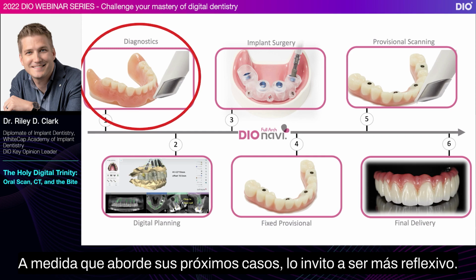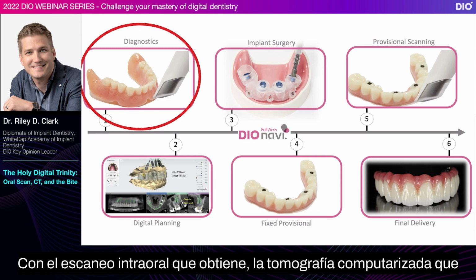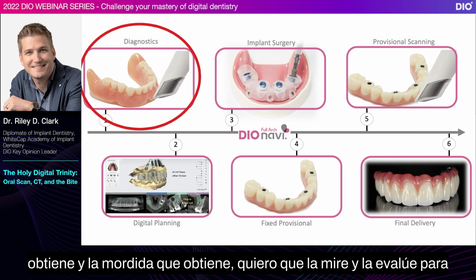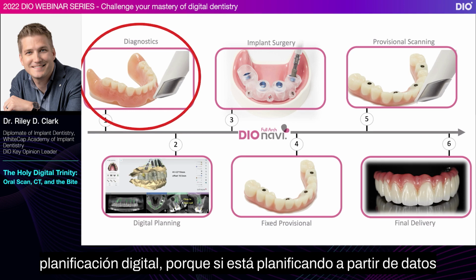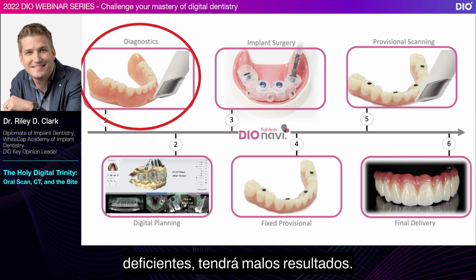So as you tackle your next cases, I invite you to be extra thoughtful with the intraoral scan you obtain, the CT you obtain, and the bite you obtain. I want you to look at it and evaluate it for accuracy and completeness before you move on with your digital planning, because if you're planning off of poor data, you will have poor outcomes.